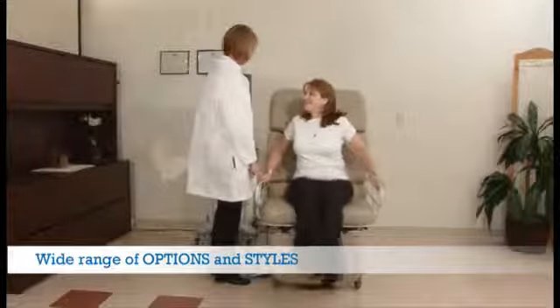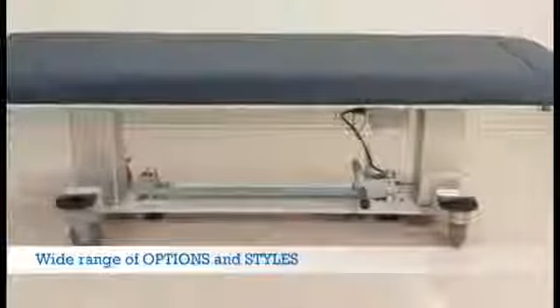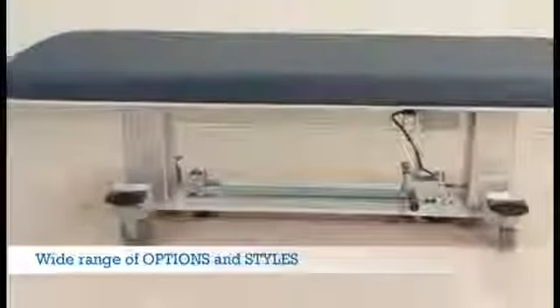To our general ultrasound models with different style tops where you can start with the basics and add exactly what you want. All tables are available in 30 inch and 27 inch widths.